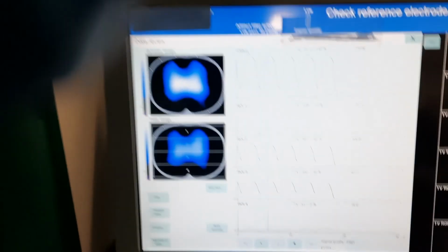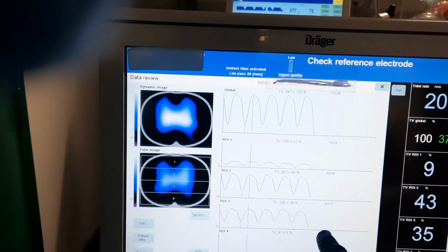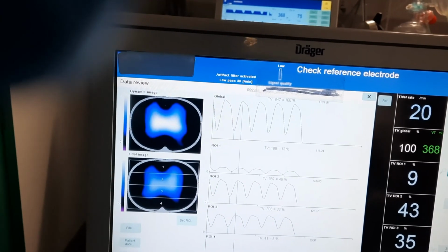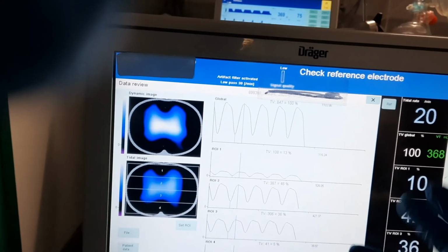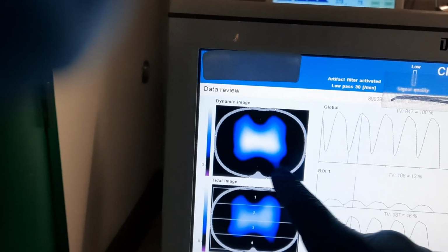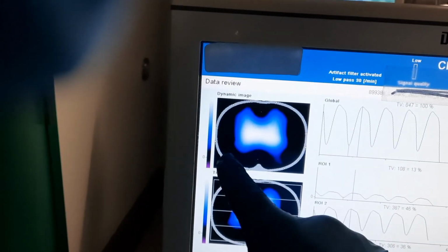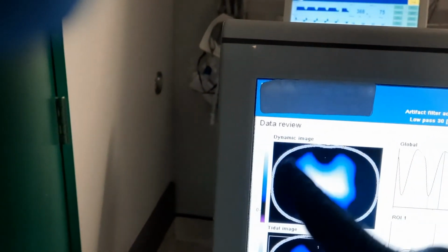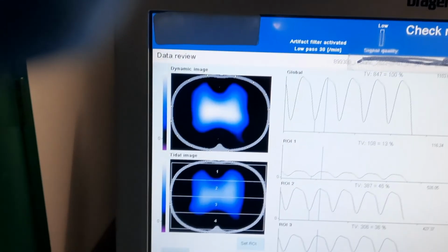This over here is the patient that is the next day, the 8th, in a prone position with the belt that was put on backwards. So here you have a slight reduction in the ventral area at 5%, but the rest of the distribution is good.